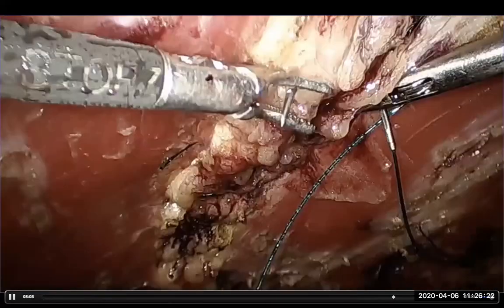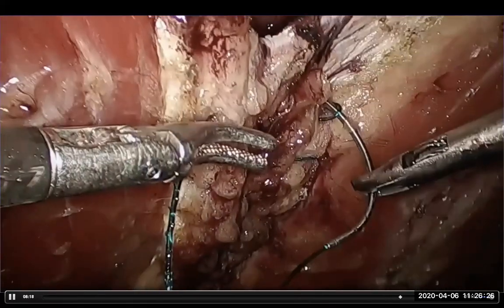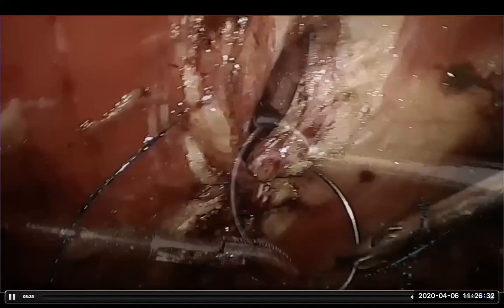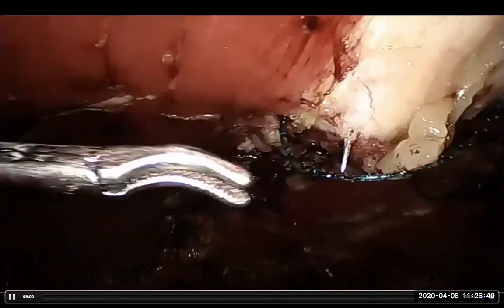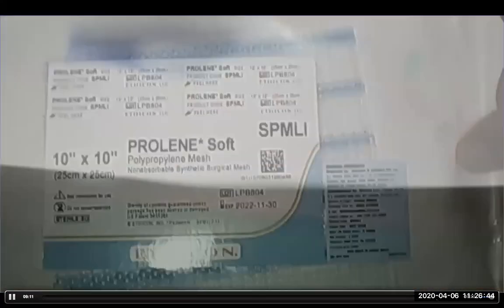So you just continue closing the midline. I would recommend doing a contralateral port to close the upper part of the linea alba, but it is also okay to do it from one side, though it becomes difficult to teach that unless you are very, very fluent in ambidextrous suturing. Okay. So this is the last bit of this one.